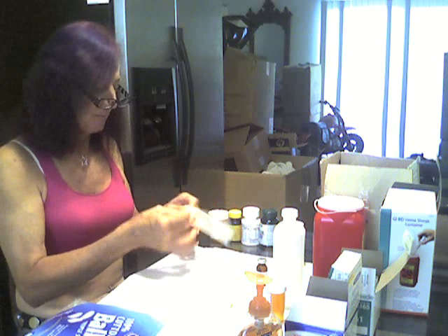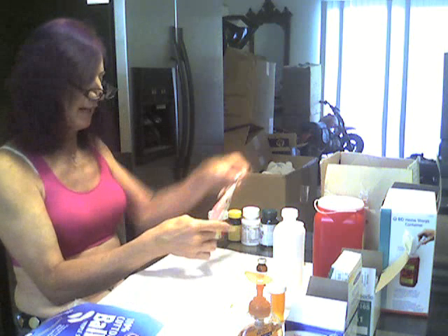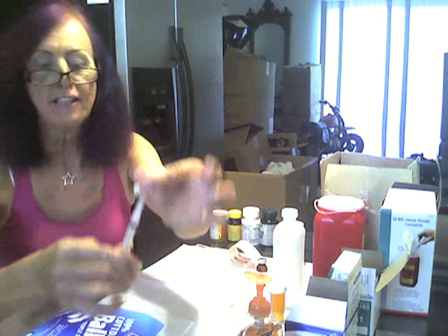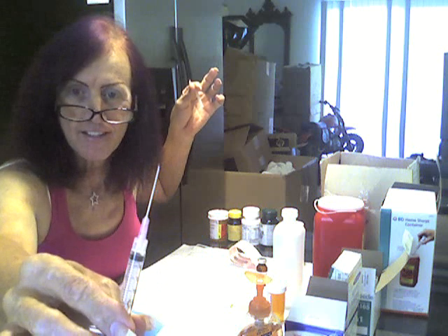To begin with, you need your 18-gauge, 3-milliliter, 1.5-inch Luer Lock syringe. As you can see, this is a very large needle — and you don't inject with this. This needle is for drawing up the solution. It would leave a really big hole in you and hurt really badly.